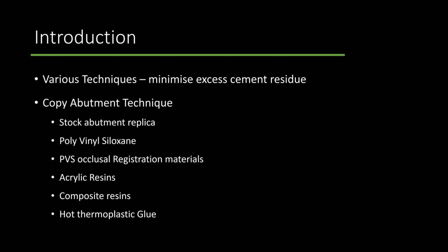Authors have described various techniques to minimize excess cement by using copy abutments made using stock abutment analog, polyvinyl siloxane putty, PVS occlusal registration material, acrylic resins, composite resins, and hot thermoplastic glue.